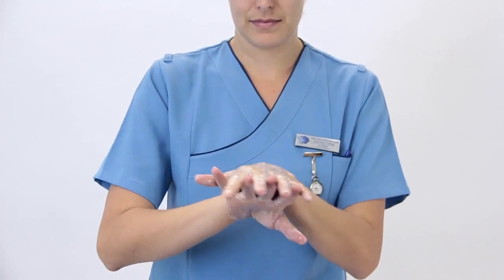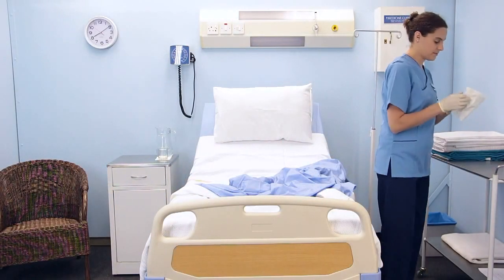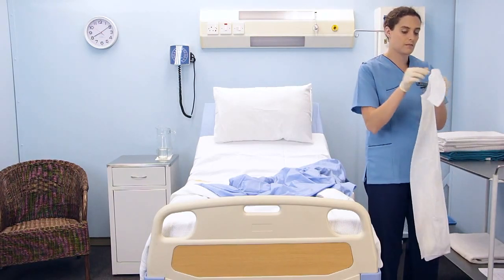Assist the patient out of the bed. The patient may sit on a comfortable chair inside the room, or the patient may leave the room while you are making the bed. We will now advance to the implementation of making an unoccupied bed. Perform a social hand wash. If the patient's linen is soiled, put on gloves and use a plastic apron to protect your uniform and prevent cross-infection.